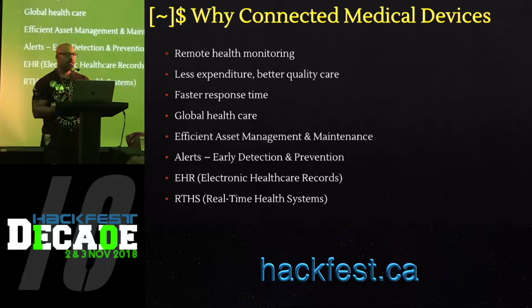And so one of the tricky things about MedJack was that it went almost undetected by endpoint security solutions. The reason it happened was because MedJack was specifically targeting older operating systems and older vulnerabilities. So operating systems like Windows XP, 2000, 2K3, and we are talking about vulnerabilities like MS08-067. And why did it go undetected? Because the newer operating systems are protected against older vulnerabilities like MS08-067, so they would simply discard the malicious packet. So the packet won't even reach the endpoint security solution.